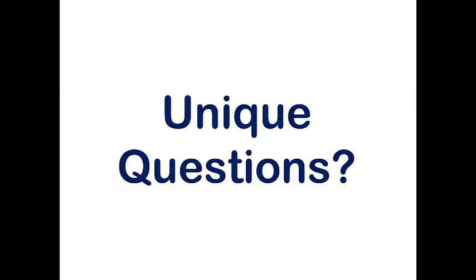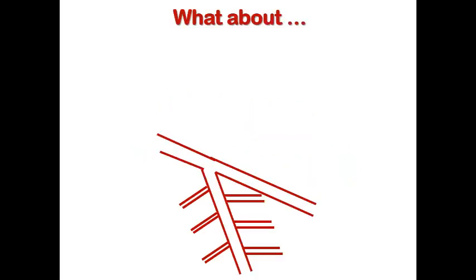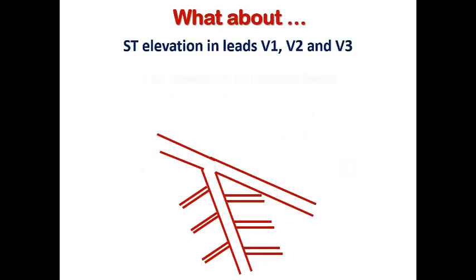Now it's time for some unique questions that may of course come into our minds regarding the culprit artery and lesion in patients with anterior STEMI. So let's answer them together. The first question: what about a patient with ST elevation in anterior leads but with ST elevation in inferior leads? Of course, this is not an uncommon example to be seen in our practice.